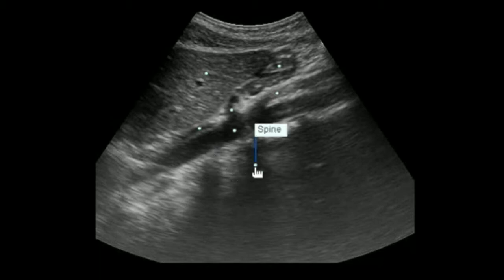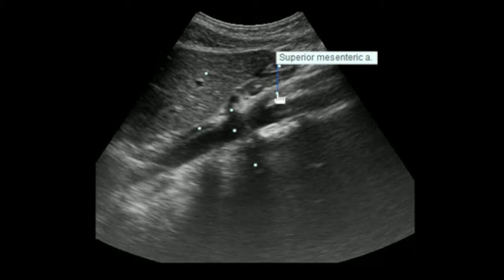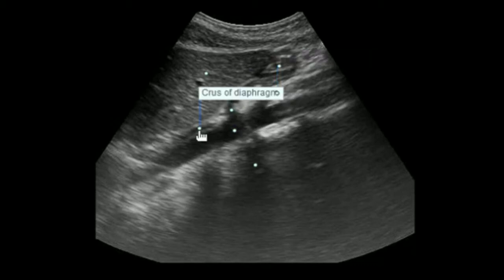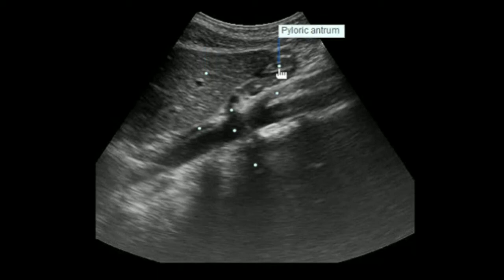This is the spine. This is the aorta. The celiac trunk, which is arising anteriorly from the aorta. This is the SMA. This is the crus of the diaphragm. Left lobe of the liver. And here, this is the pyloric antrum.